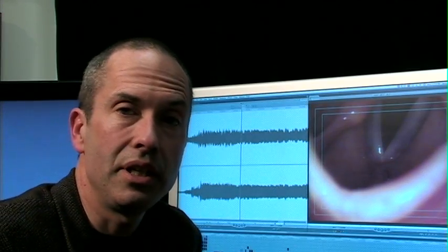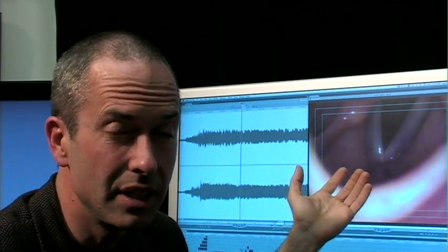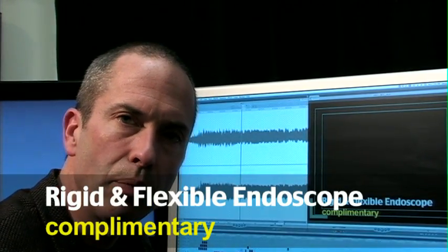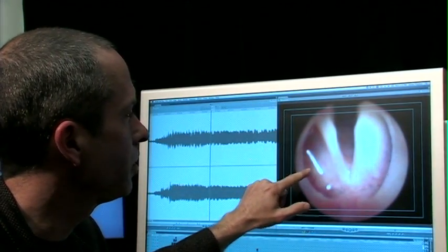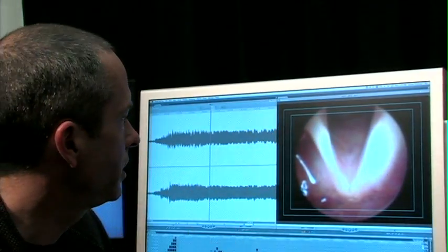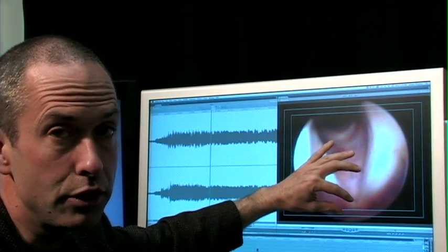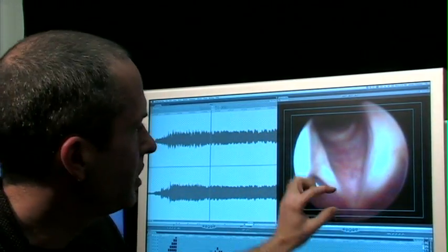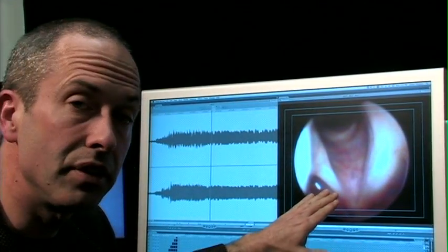With the rigid view, we can pretty clearly see that the right vocal cord is not opening and closing — it's paralyzed. The question is: is that paralysis the cause of the hoarseness? Well, not really. We'll put in a flexible endoscope and get a different perspective on the same patient. By zooming in on the vocal cords, we can see that the right vocal cord is actually much thinner than the left. The ventricle on the right is much bigger than the left. There is a great inequality between the two vocal cords. Slipping in a little further to look along the edge of the vocal cords, we can further appreciate this discrepancy. The right vocal cord is really nothing more than a noodle — there's no muscle left within it. On the left side, the mass is probably 10 to 20 times greater. That's the muscle itself.